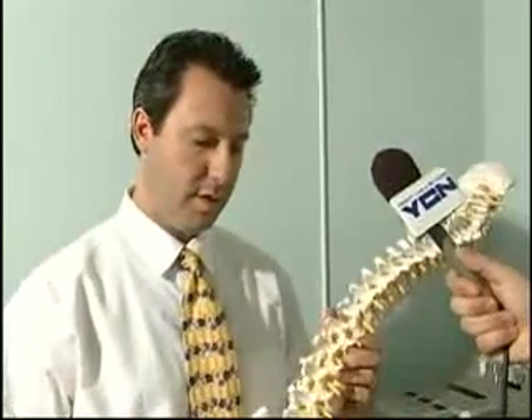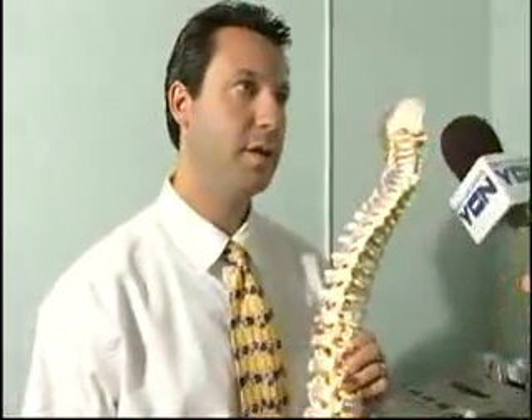Being one of the only ones in this area to have it is quite a good thing. It does come with a sacrifice — it's one-on-one time with a patient and you can't be doing anything else. But it's worth it. We have the toughest patients come here to use this, and we've had great results. I'd say 70% to 80% get at least some type of moderate relief — and that's our toughest patients.